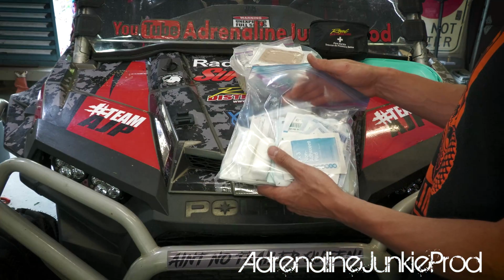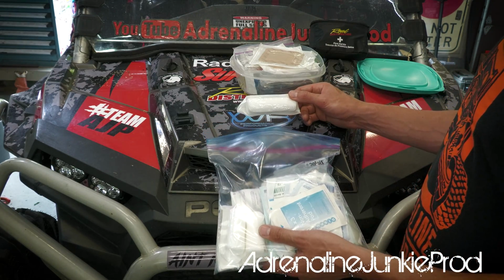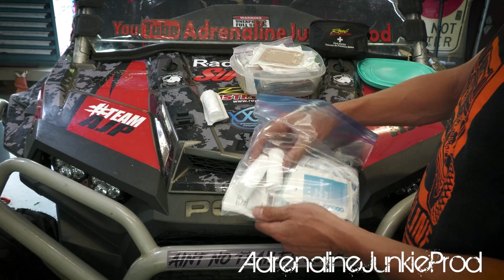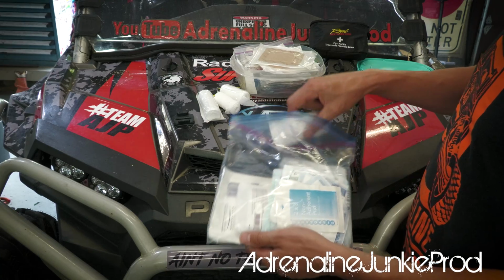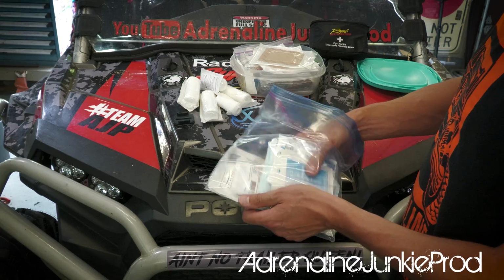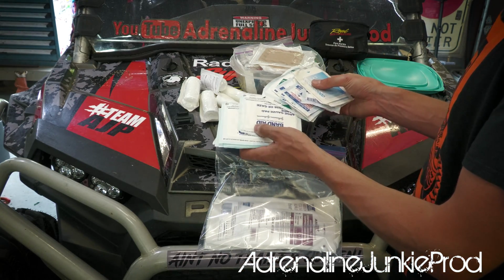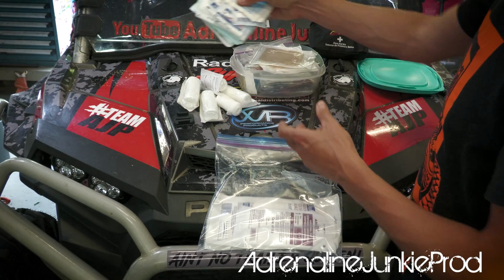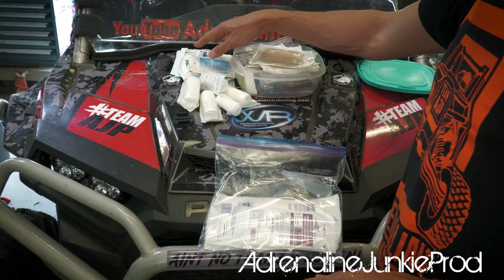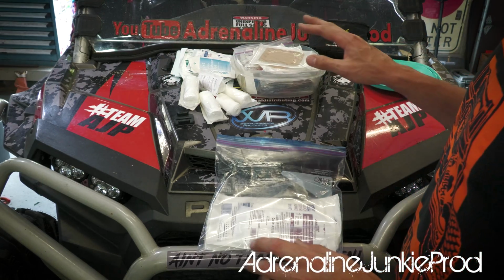You don't want half a first aid kit where the stuff you need isn't in there because you used it last time. One of the most important things I find that the smaller kits omit because of space issues, they try to put together a small compact kit, is they don't give you enough gauze, enough cling gauze, enough wrap. So here you see I've got a ton of individually wrapped gauze. We've got a bunch of different non-adherent pads, gauze woven sponges, different sizes, absorbent pads, stuff like that, because this is what you're going to clean the wound with. That's what you're going to clean the area with. That's what you're going to put over the area you need to protect. That's what you're going to get wrapped up in this once you clean the wound, stop the bleeding, whatever you need to do.